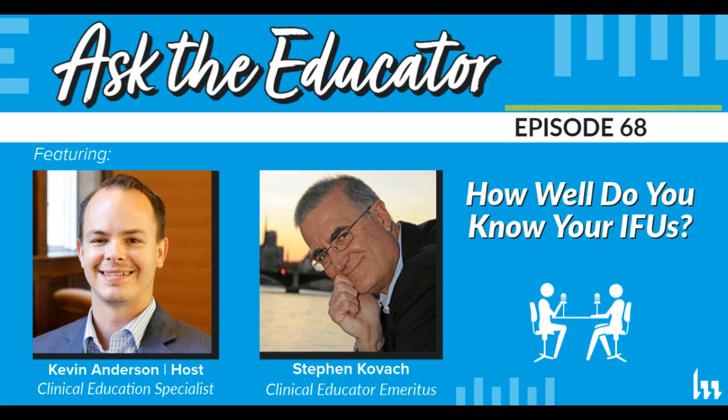And just so you know, they're Fraser suctions, and you buy a Fraser suction from different companies, you have different IFUs. So you can make a good policy that all suctions. So what is written? How are you going to do it? How are you going to train your staff? And this gets back to something we addressed earlier.